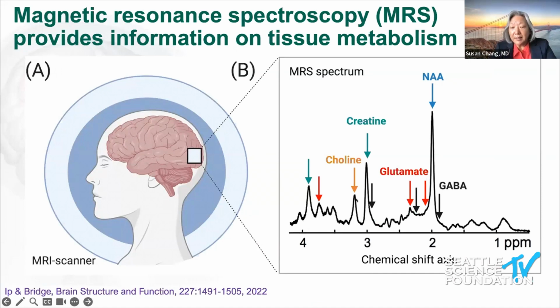We'd expect to see some choline, creatine, and a high amount of N-acetyl aspartate, which is reflective of neuronal components. And so by doing this static or steady state acquired images of the brain and tumor, we can try to characterize differences in what we call this metabolic fingerprint that exists within normal tissue versus tumor.